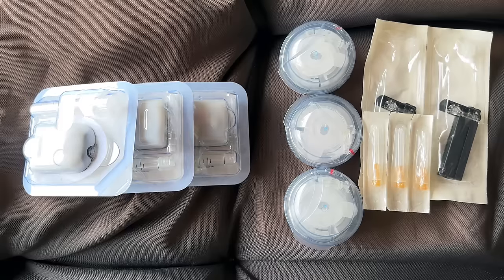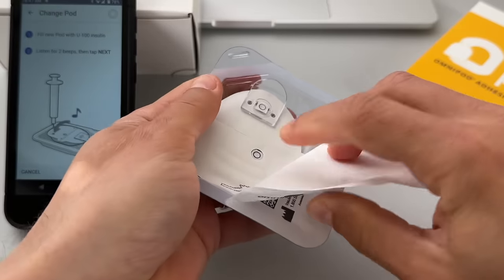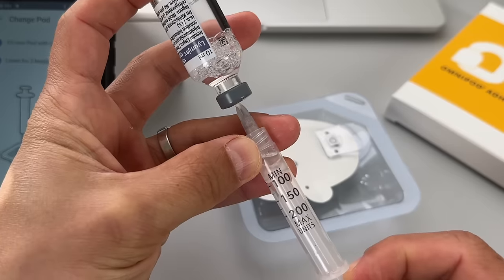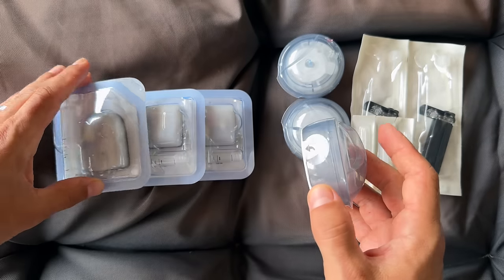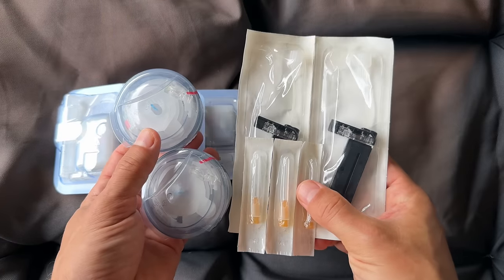Another advantage of Omnipod 5 is that when you travel you don't need to carry a lot of supplies. Each pod is stored in a relatively small and flat package along with the syringe you need to fill it with insulin. With T-Slim X2 you'll need to pack infusion sets, cartridges, syringes, and needles, so you end up carrying a lot more.